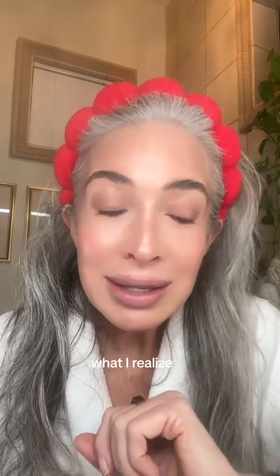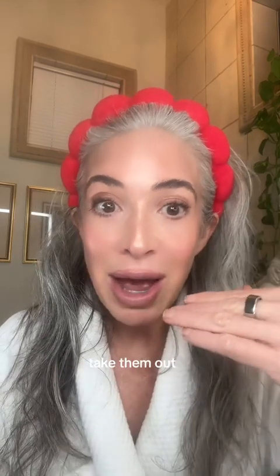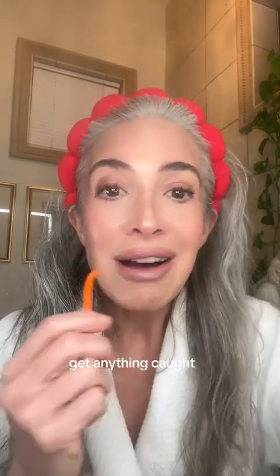And then I went about my way, and I realized you're supposed to wear these 22 hours a day. That does not leave much time for eating. And I'm a slow eater, so you're trying to do your best. Then I realized, okay, finally I get home and I drink a lot of water. By the way, you drink a lot more water because that's all you can drink. When you've got these in, you have to take them out if you're gonna drink or eat anything, especially with color, or you don't want anything caught in there.